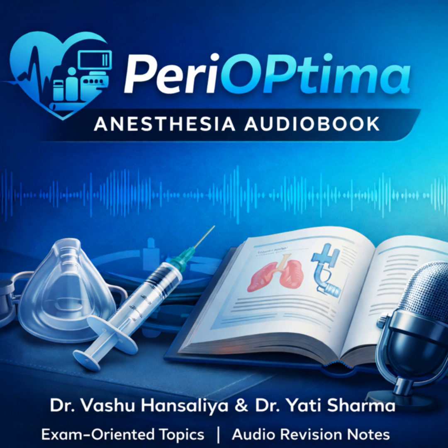Got it. And finally, PSV versus CPAP. PSV provides an active inspiratory assist, that pressure boost, and it's flow cycled. CPAP. CPAP provides no inspiratory assist. It's just a constant baseline pressure to stent the airways open. Excellent. We've mentioned trauma a few times. Let's categorize the complications properly under the umbrella term VALI, ventilator-associated lung injury.